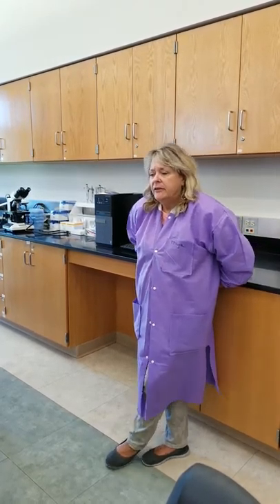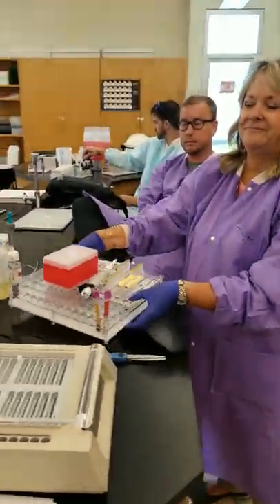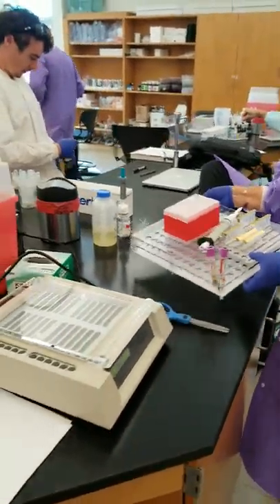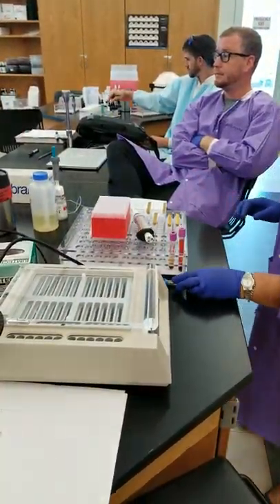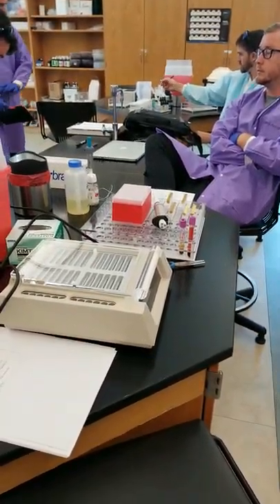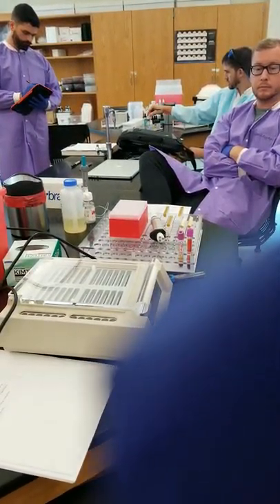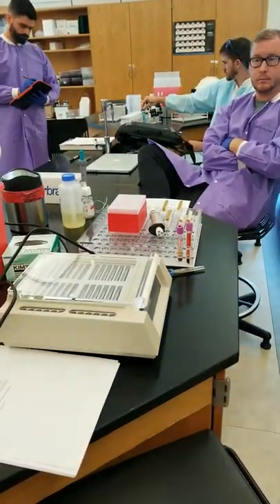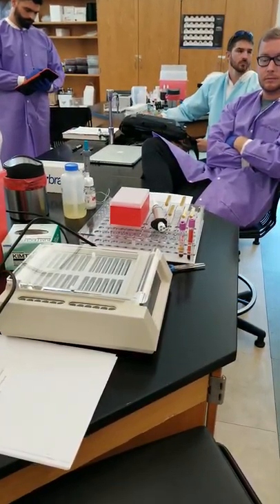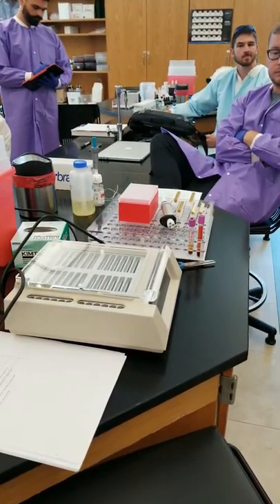So this is what we call the MTS gel system. It was developed over in Europe and then it was brought into the United States. They have other companies. This particular company is Ortho. Ortho was the one that brought it into the United States originally. The patent on the technology has expired, so now you see other manufacturers producing similar setups.